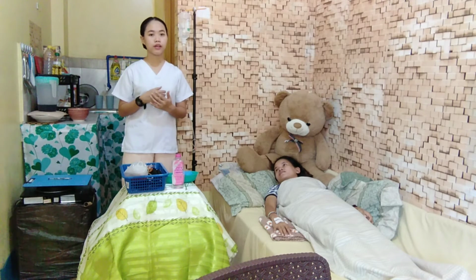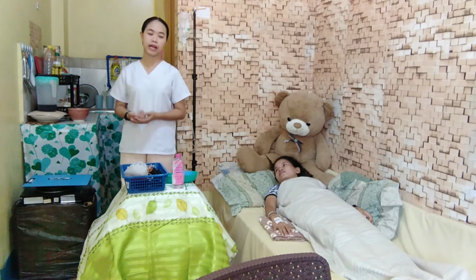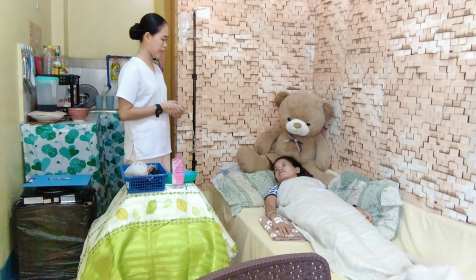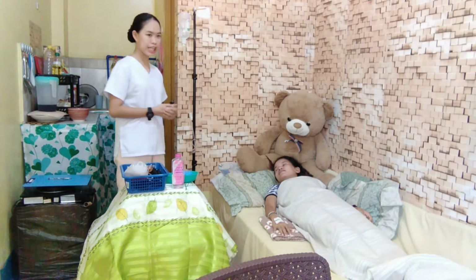After that, we will identify the patient and check the availability of the blood in the blood bank. So, ma'am, may I have your complete name and your birth date? Mariam Larry Ruiz is my name, and I was born on December 17, 1999. Okay, thank you so much, ma'am.